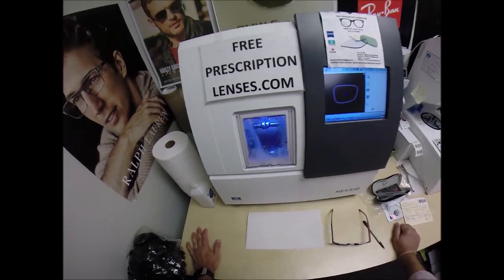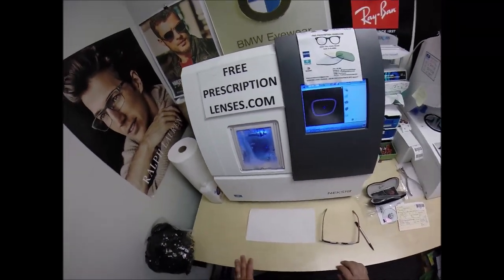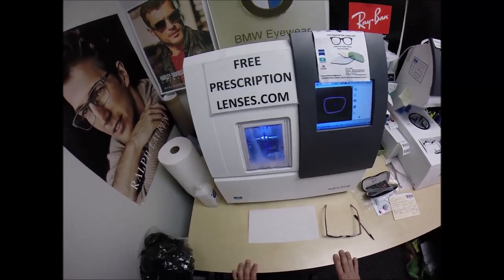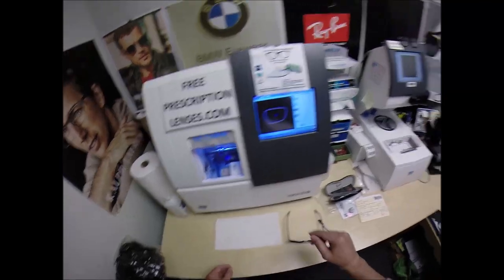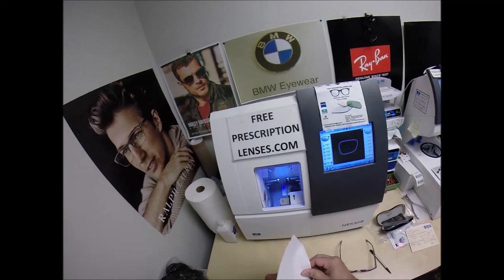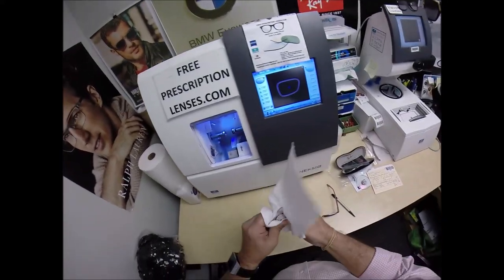These lenses have the most complete protection of any lenses that I offer. The Photofusion Extra Gray comes with either five colors of flash mirror: silver, gold, green, blue, or red.